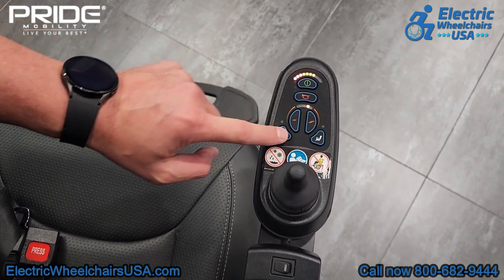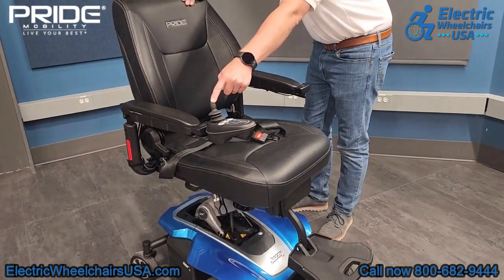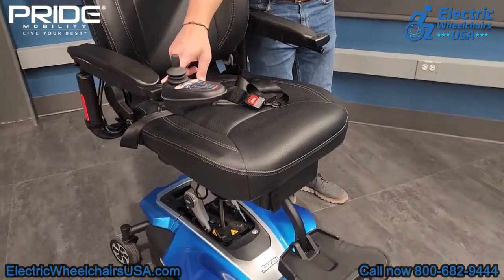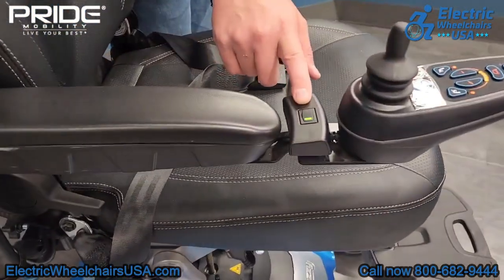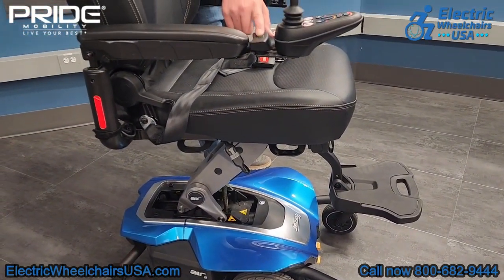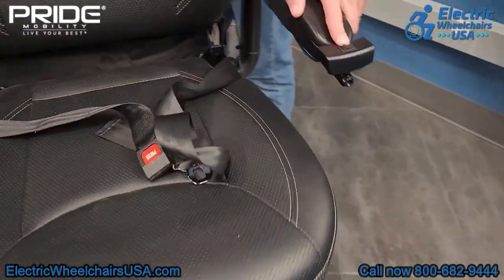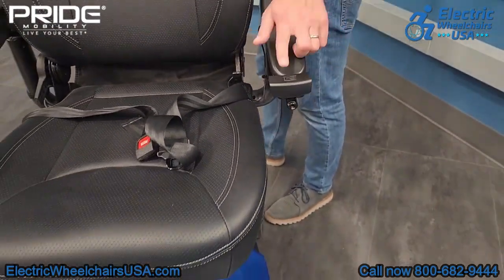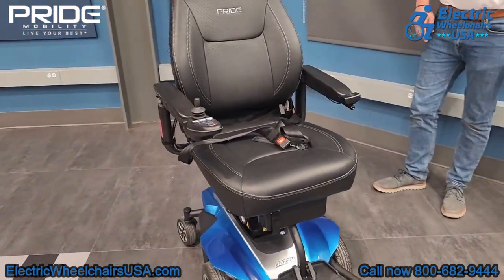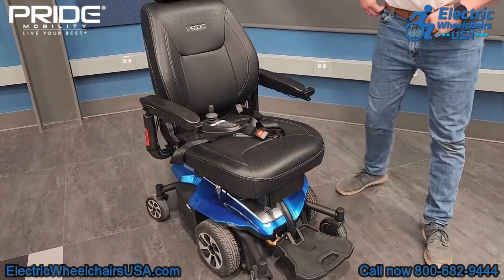On the joystick, in the bottom left corner, pressing that button will engage the power elevating seat. Holding the joystick back will elevate the seat up, and pressing it forward will lower it back down. The switch underneath the joystick controls the front headlights. There's also a power elevating seat button on the other side of the power chair — pressing the switch will raise or lower the seat. You just press it once and it will lower or elevate all the way without holding the joystick.